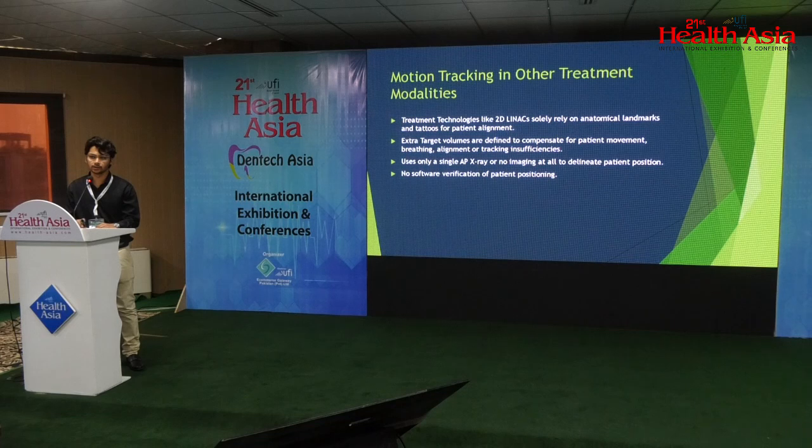Some older modalities have AP X-ray imaging, so we just have an initial position of how the patient is positioned. And on top of that, there is no software verification in older technologies.